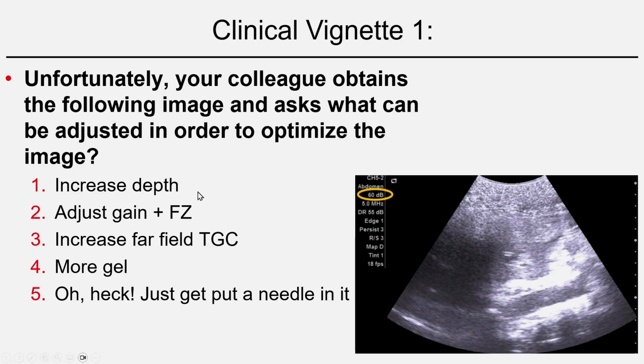Would you adjust the depth? Would you adjust the gain and the focal zone? Would you adjust the TGC? Would you use more gel? Or would you just say, oh, heck, just put a needle in it already, and let's get out of here.